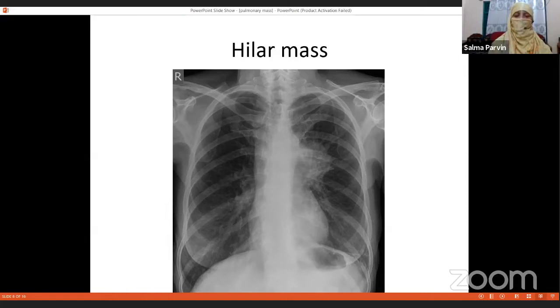All those three important things will make you conclude a decision on whether this is a mass or a consolidation. All three things will give you an impression that there is further involvement of the organic structures, local, hilar and mediastinal. So thank you for hearing with patience.